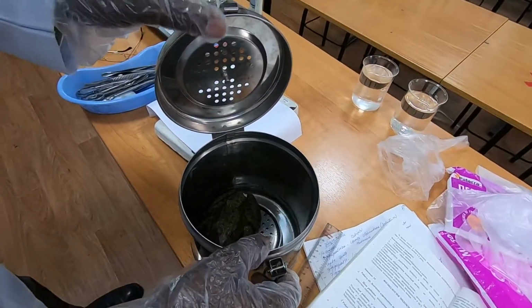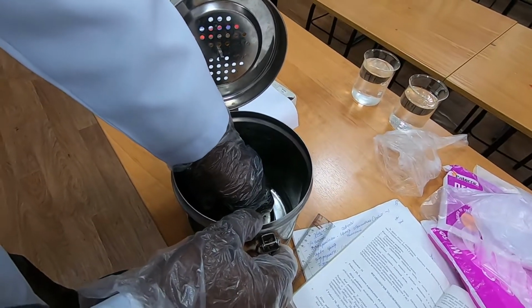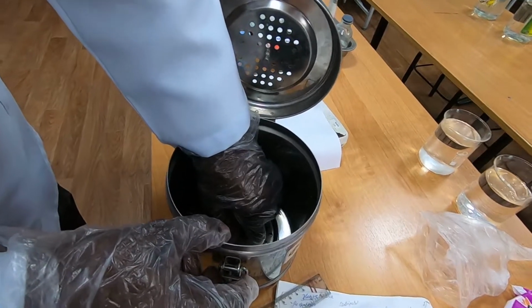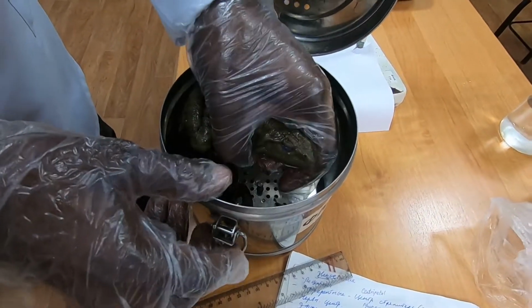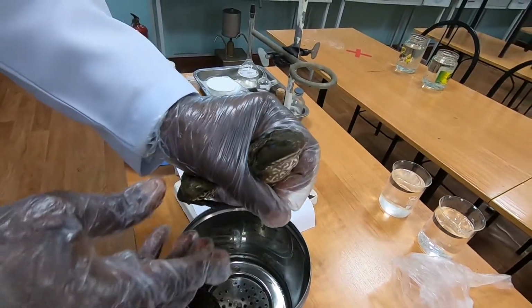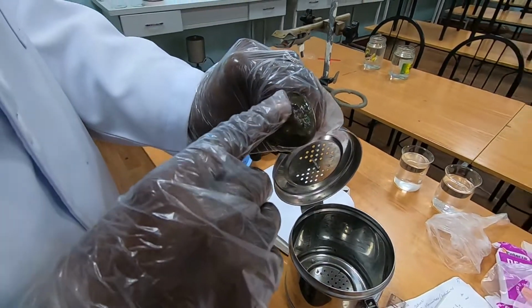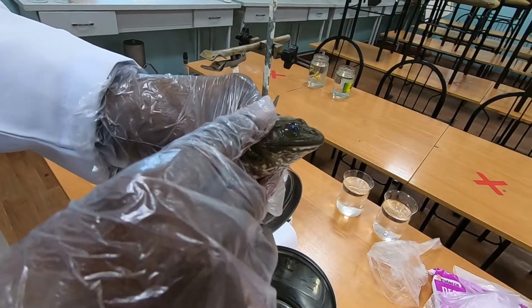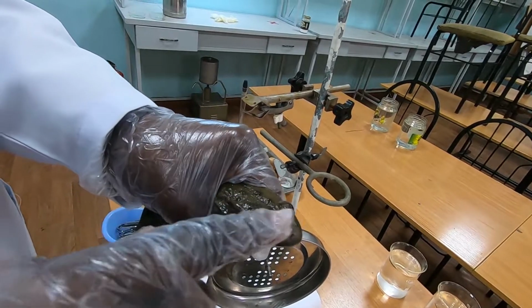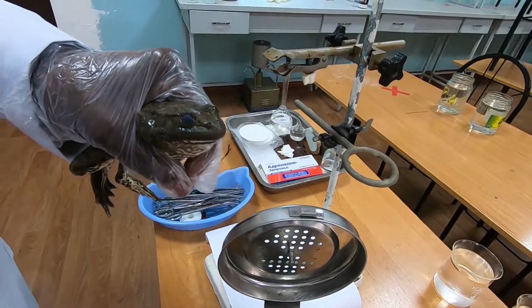Okay, here we go. We're going to take one of the frogs. Okay, very carefully. You have to handle it with care. All right? So, yes. So this is how we're going to remove the eyeballs. You can see the eyeballs here. So we're going to remove them. So how do we do it?